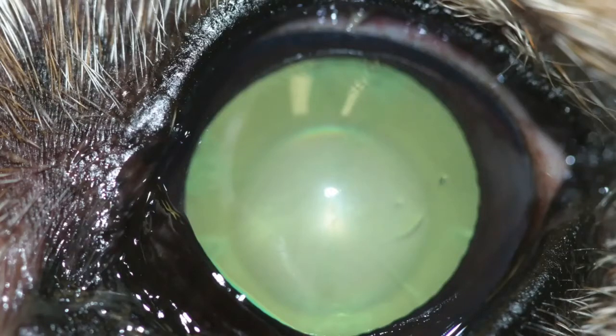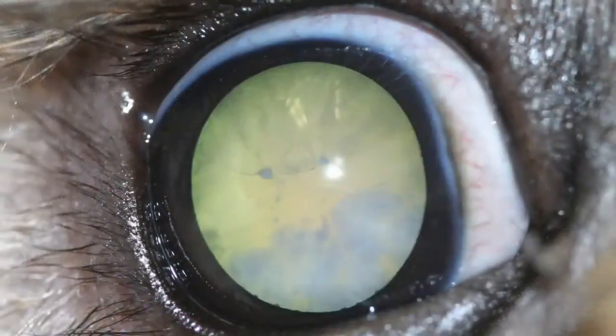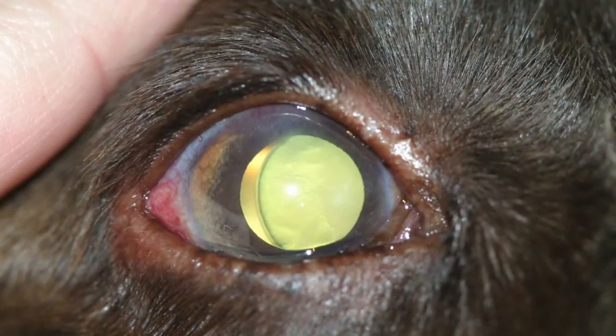Dilation aids in differentiation of nuclear sclerosis versus cataract and will enable the clinician to appreciate an aphakic crescent if present, in case there is lens subluxation.